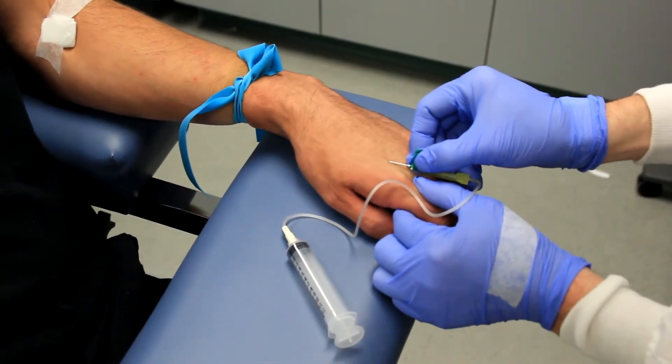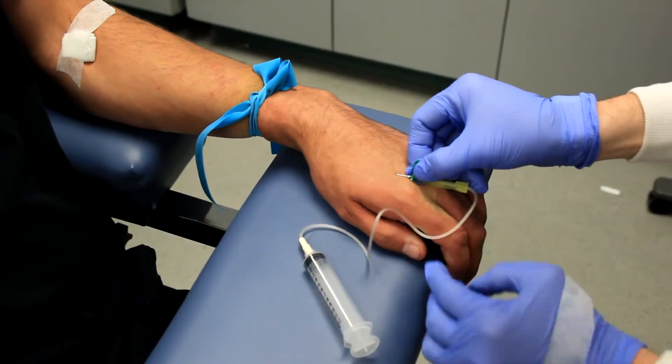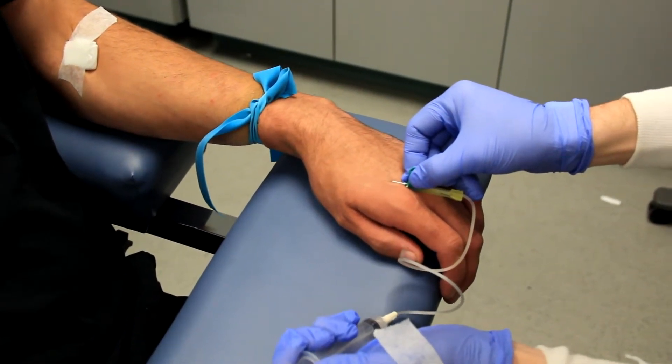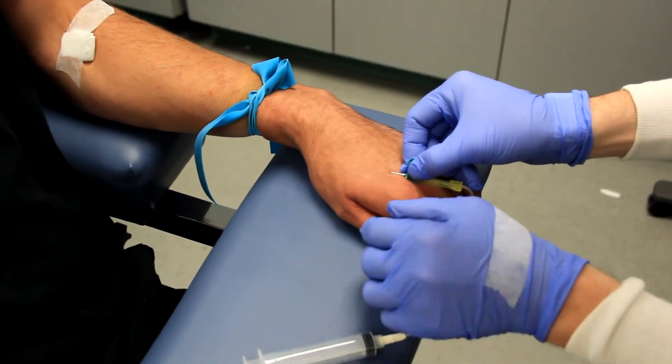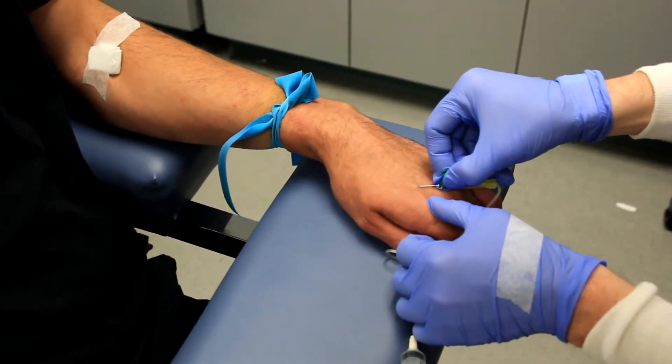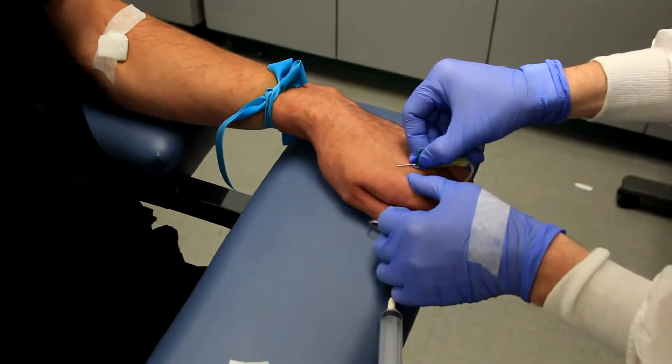At no point should the needle ever be released during the venipuncture. After insertion, use the hand you are using to anchor the patient's skin to draw back on the plunger of the syringe. If you fail to enter the vein initially, repositioning with the butterfly is accomplished the same as with any other needle.